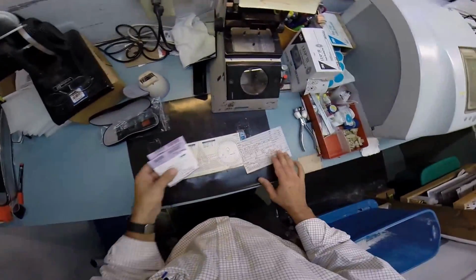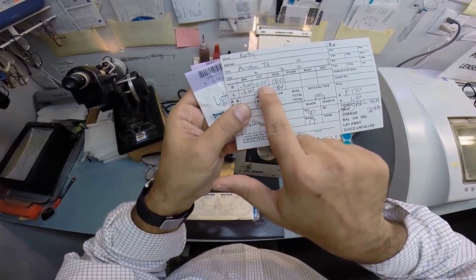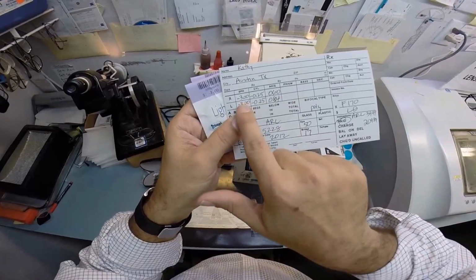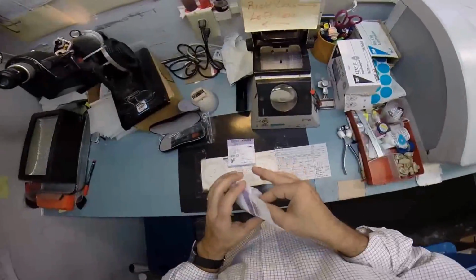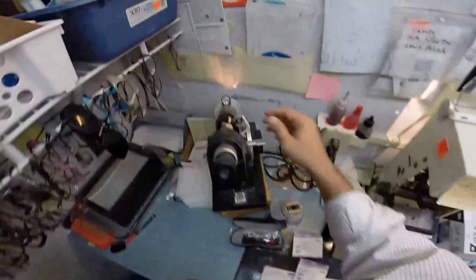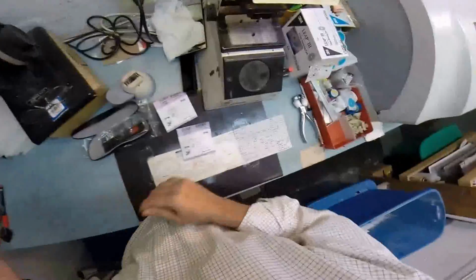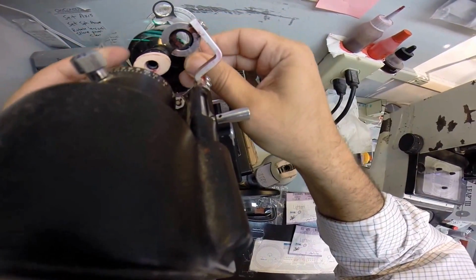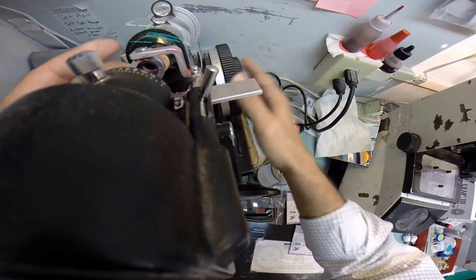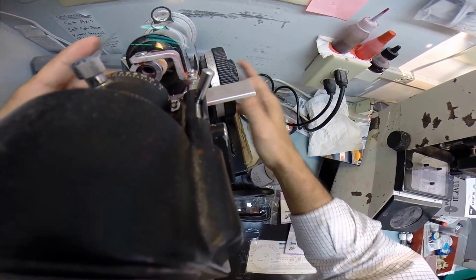So let me take your lenses. You are actually very rare. You have the same powers in both eyes, -3, -1/4 at 60, -3, -1/4 at 84. So both of these, -3, -1/4. I'm going to take the first lens, take it out of its protective sleeve. I'm going to spin the axis wheel of my Marco 101 lensometer to 60. I'm going to put the lens in, turn the power drum to -3. I'm going to put your lens in and rotate it until the sphere power comes in clearly. Find the optical center. Double check everything, your astigmatism correction, everything's lining up good.